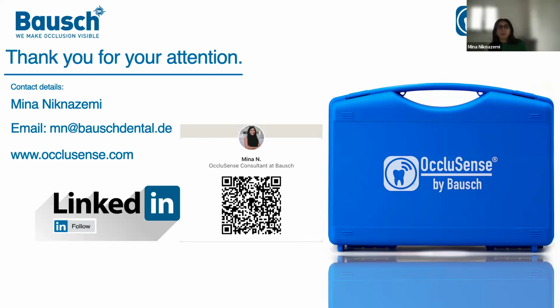In theory, you're absolutely right. Practically, you would have to really insert the sensor in exactly the same position as you did before for the color to be gone in exactly that area. And actually, the color on the sensors is put on in a way whereby you are able to use it multiple times. Okay, I get the point.